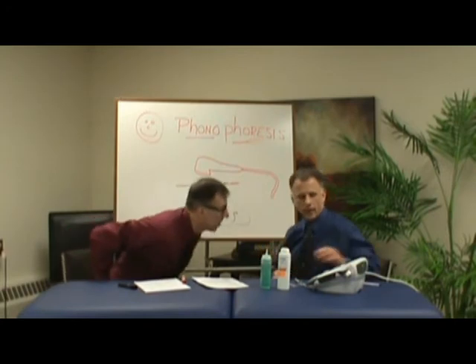Now, this is one thing as a patient: when a patient comes in dressed like this and you're going to do their shoulder, you've got to get the skin exposed. Typically the shoulder is up in here, right on the lateral side. You can't treat through clothing, so you really do have to expose the skin where you're going to treat.